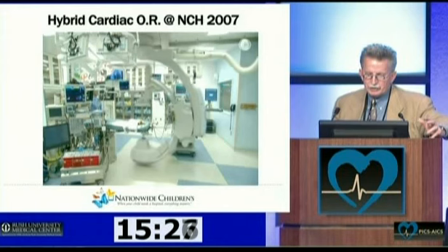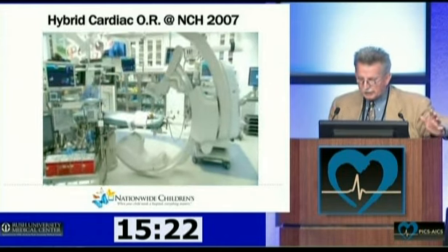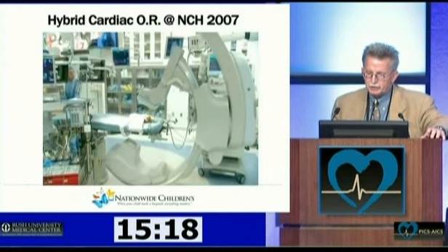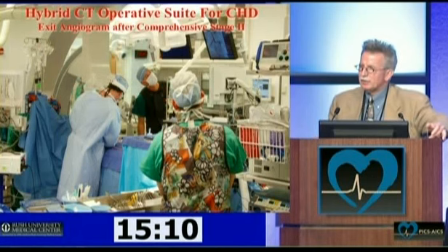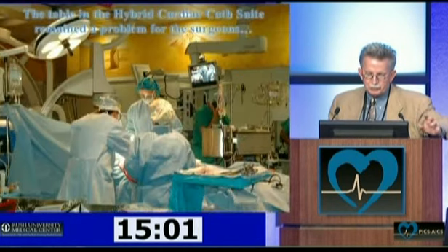But then, as you can see, we drive the equipment in so it stays out of everybody's way. It's not floor mounted, but ceiling mounted, and then does all of the complex angles that you want it to do the procedures. And then, of course, we centered all of our suites together. And then what we really did in the hybrid OR to start with was we started exploring exit angiography. And it was a little bit of a challenge, and you can see why. I'll show you some films here at the end.